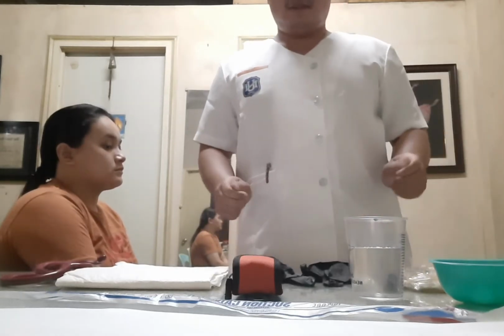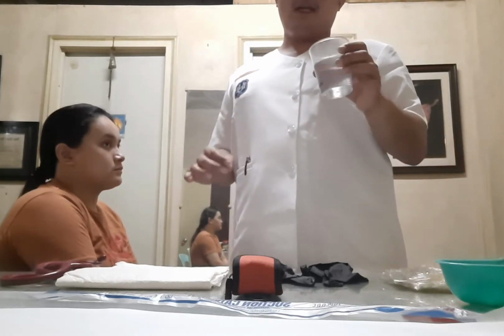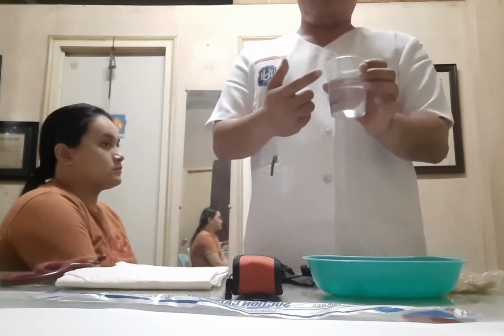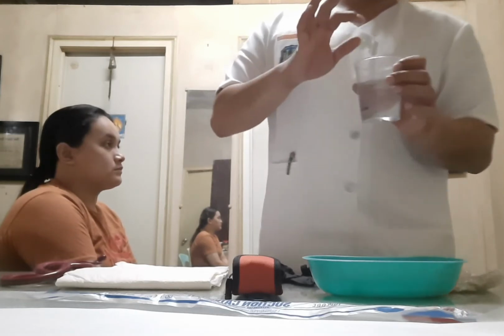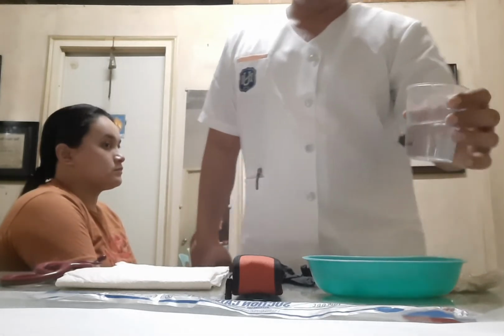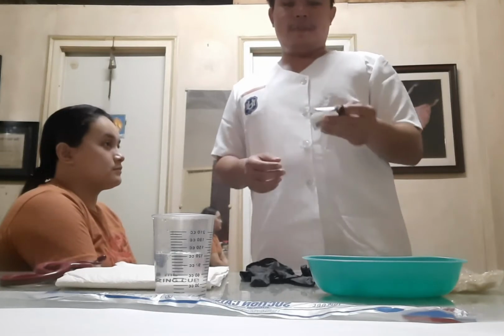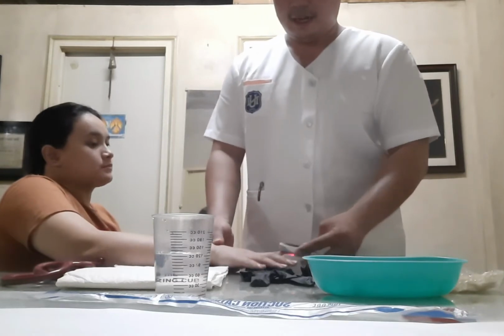So here, if your NSS is already open or new, you need to pour it into the kidney basin so that the outer layer of the normal saline solution, or the microorganisms that stay on the NSS, will be poured out. Now, we will put the pulse oximeter to monitor the patient's pulse ox. Assuming that the patient is already in the semi-Fowler's position.